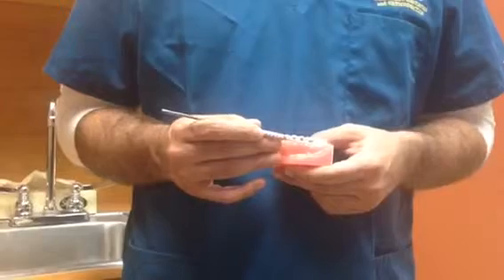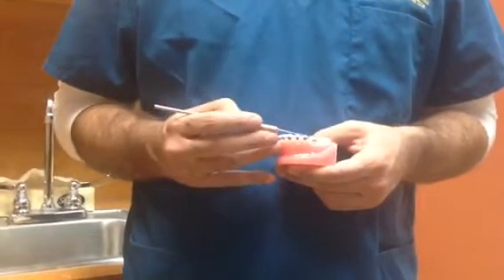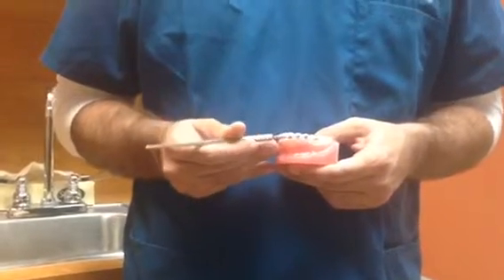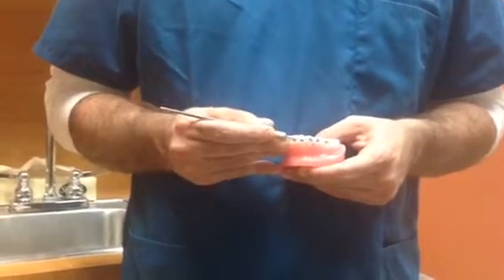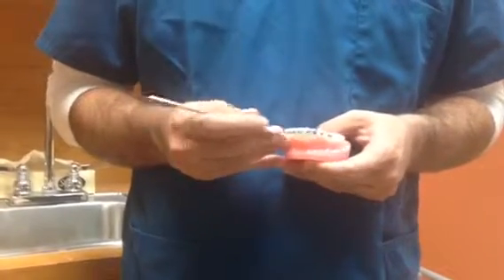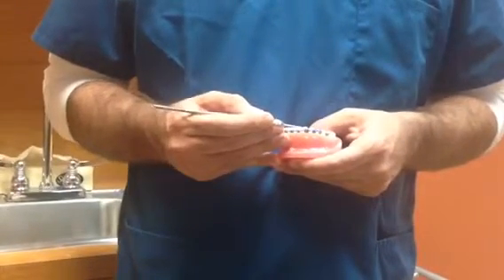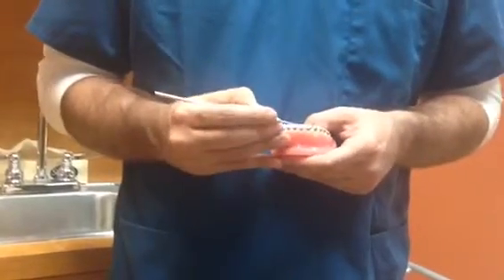You want to start all the way to the end of the bracket, and from the top to the bottom of the tooth, make sure you don't poke yourself in the gum, and you want to go all around from the end to the other end of your arch. Gently from top to bottom, you will remove and hook the power chain off of the brackets.